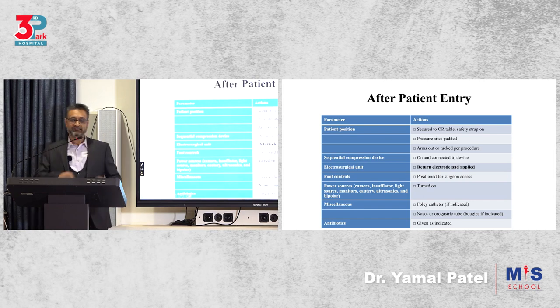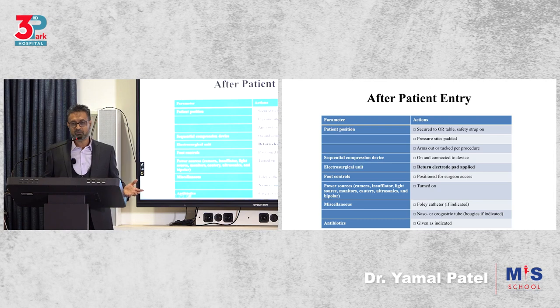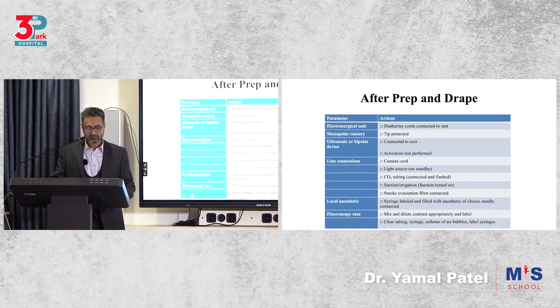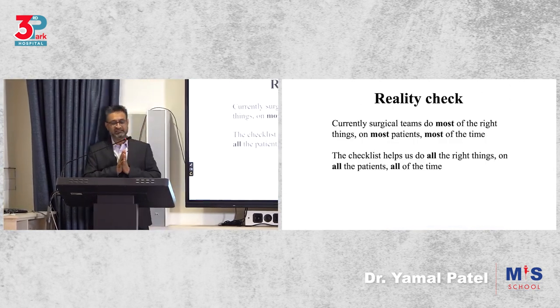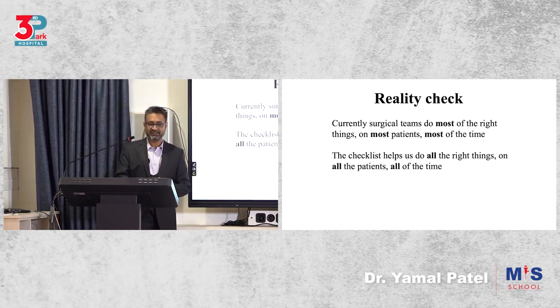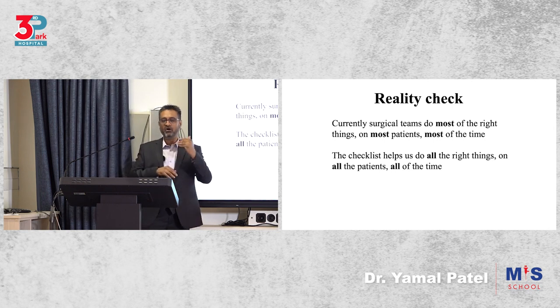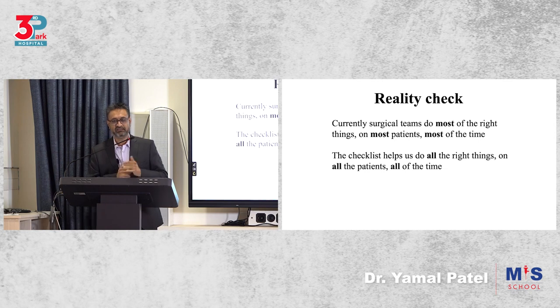Is my bipolar connected? Is it tested? Fill it on a gauze and test it and listen. Is the monopolar working? Not when I start, then you start setting it up, okay? So this is prep and rep. So please understand, currently, most surgical teams do most of the right things on most patients most of the time. What should be the ideal? This checklist makes us do all the right things on all the patients all of the time. You see the difference? Not most, all.